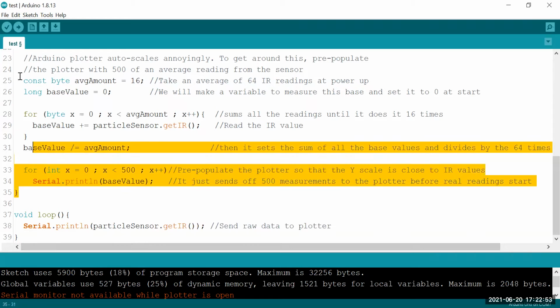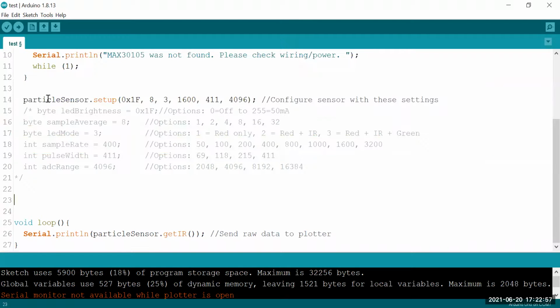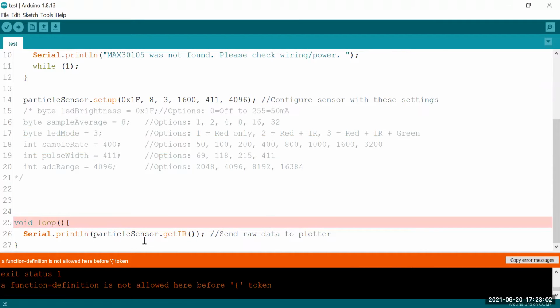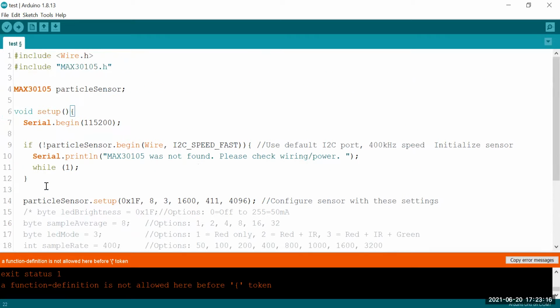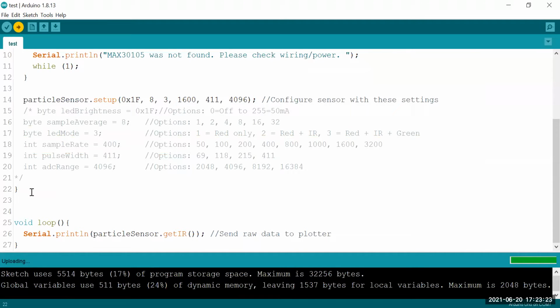I'll show you what happens if we don't have any of this auto-scaling math. So I'm going to copy, exit, upload it back to the board. Now what did I do? A function defined here is not allowed. If, I needed, there we go. Yep, now that error message was saying essentially is that my setup function did not have a curly bracket at the end. So now it's done uploading.